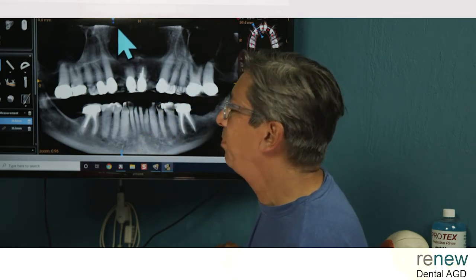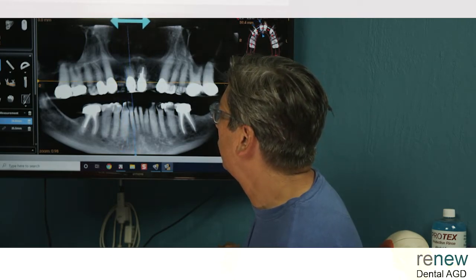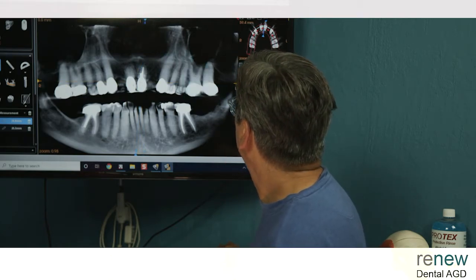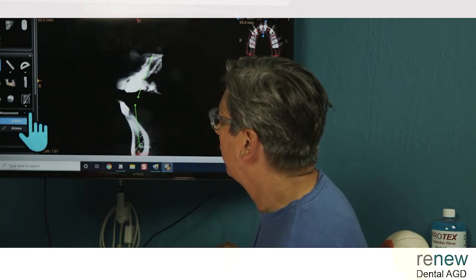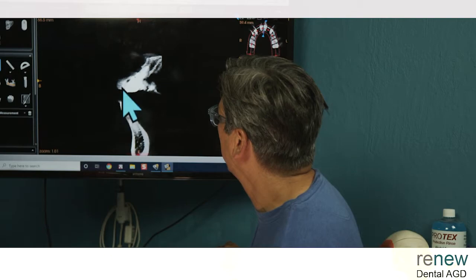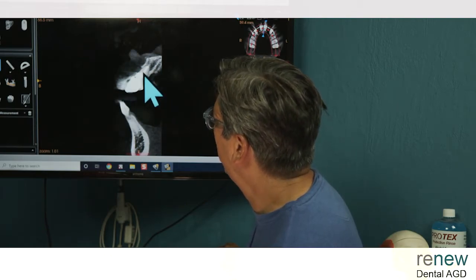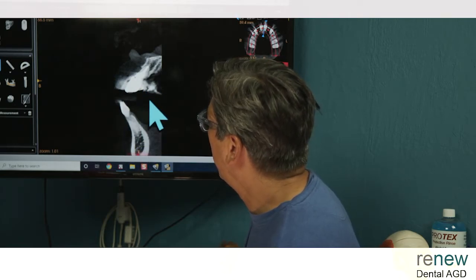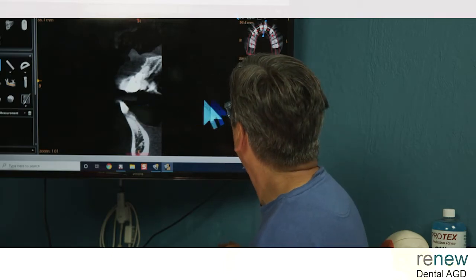So this is a pass for me, because I'm not really sure what this patient wants to do here. He's got this fractured tooth, and this is really hard to overcome. Let's get that looking a little better there. There, it looks better. So here he's lost a ton of facial plate because of the fracture. And, you know, I don't know what else you're going to do here.